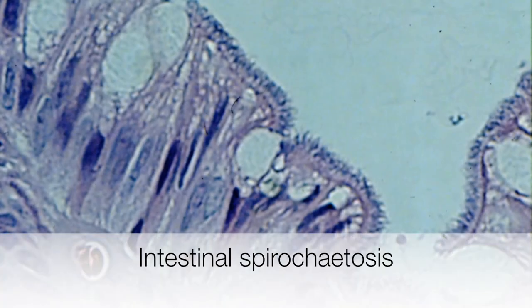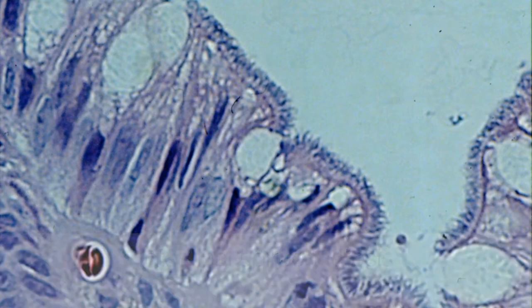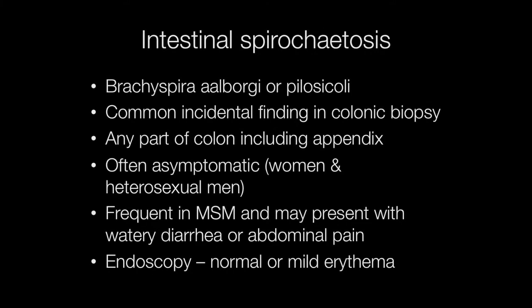This is a nice example of intestinal spirochetosis. Intestinal spirochetosis is a common incidental finding in colonic biopsies. It can affect any part of the colon, including the appendix. It is often, in fact, usually asymptomatic, particularly in women and heterosexual men. But it is a frequent finding in men who have sex with men and may present with watery diarrhoea or possibly abdominal pain.